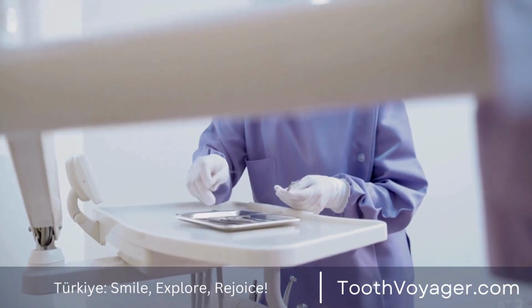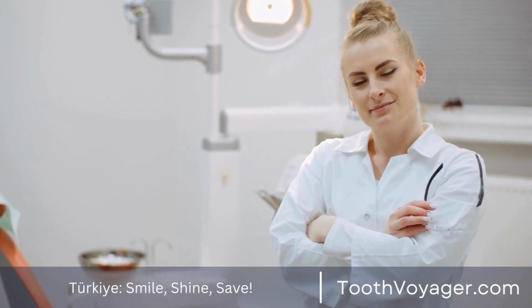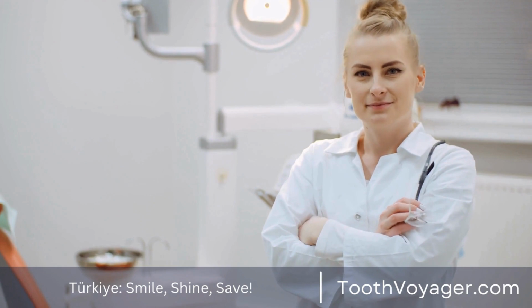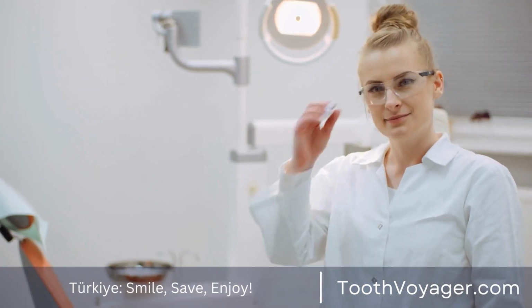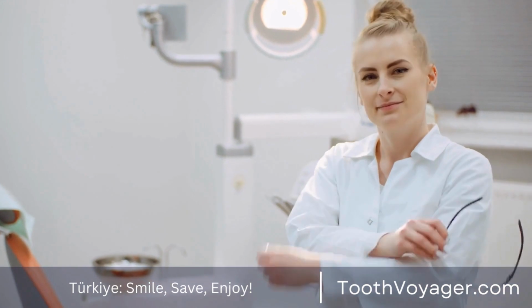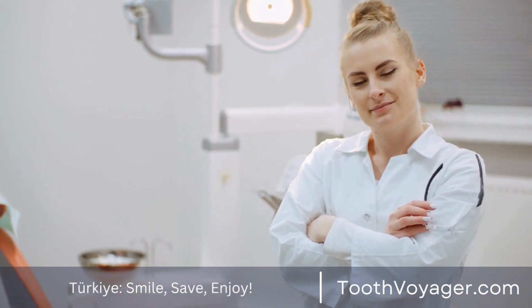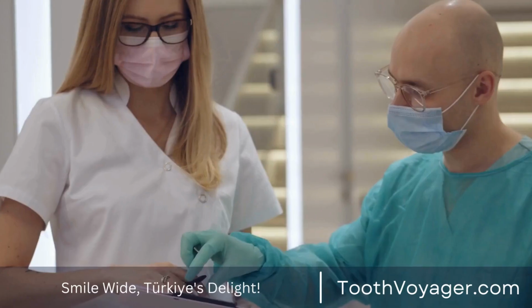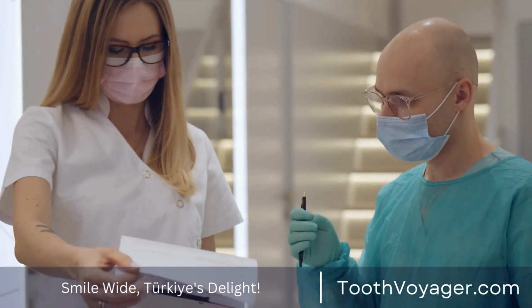The procedure for getting a dental bridge. The procedure to get a dental bridge usually requires numerous visits to the dental office over the span of several weeks. First, the visit involves preparation of the natural teeth that support the bridge by shaping them to ensure that the crowns will sit over the teeth. The dentist will also take impressions of your teeth and create a mold of the bridge.